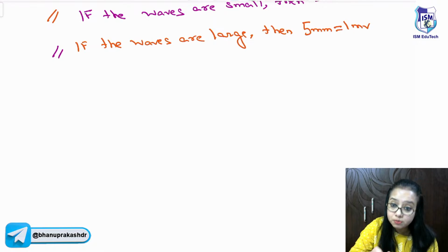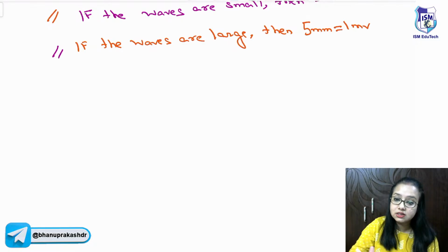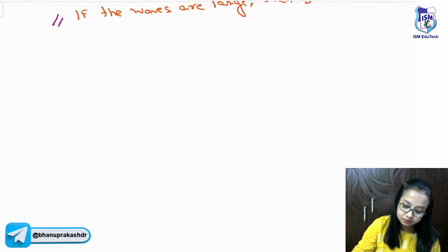One very important point to remember is to make sure that all this setup, the electrical connectivity, the calibration, the speed, everything is maintained perfectly. Otherwise, the ECG waves that will be manifested on the paper cannot be taken as correct. That is a very important factor.